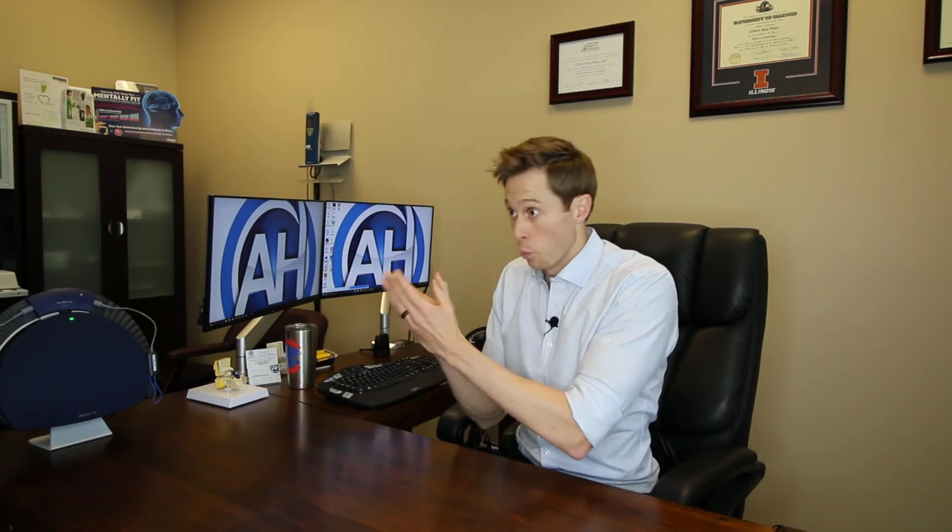Because so many people think that like, well, I have a really good hearing aid, so that will provide me with the absolute best level of hearing. And it will, right? So the best hearing aid will provide you with better hearing if it's been fit appropriately, if it's been programmed appropriately.